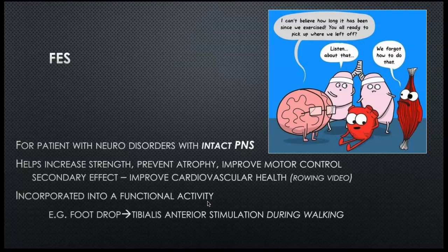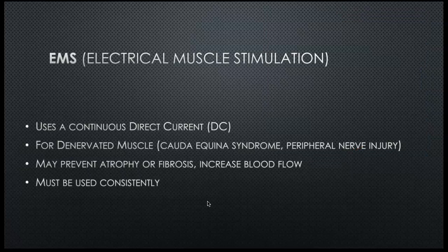The big thing with functional electrical stimulation, it's very similar to like the Russian protocol, but you are using it at the same time you're doing a functional activity. So a really commonly used FES is you stick the e-stim on the tibialis anterior muscle and you're trying to stimulate it so you get ankle dorsiflexion during walking, and you time it with when you want somebody to dorsiflex. So this is used with people who have foot drop a lot of times.